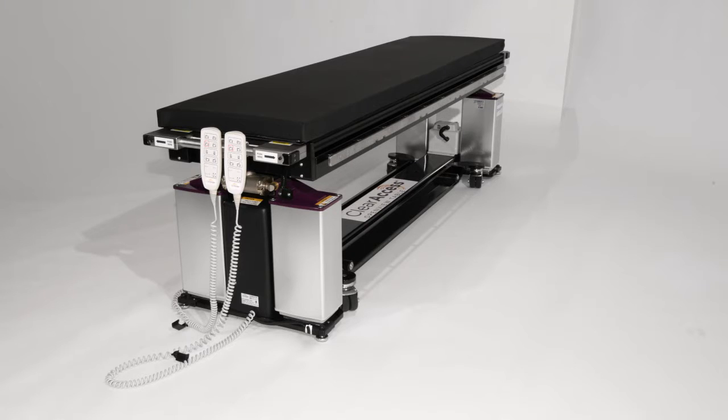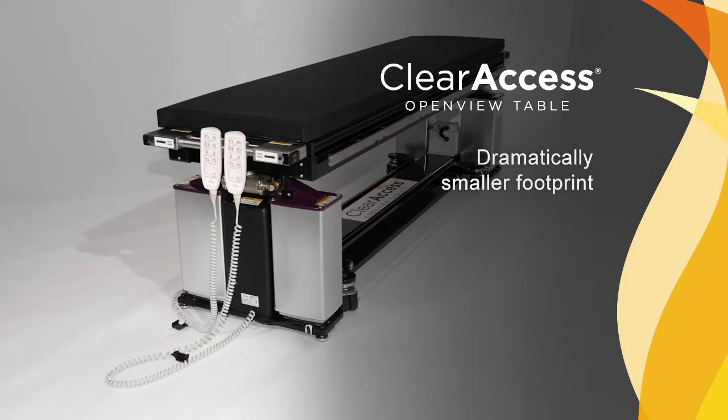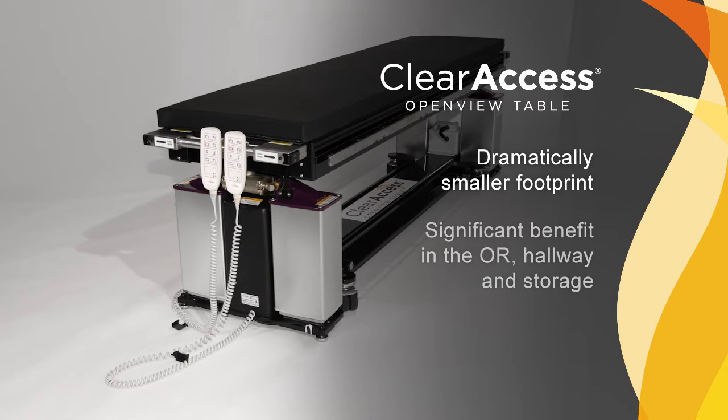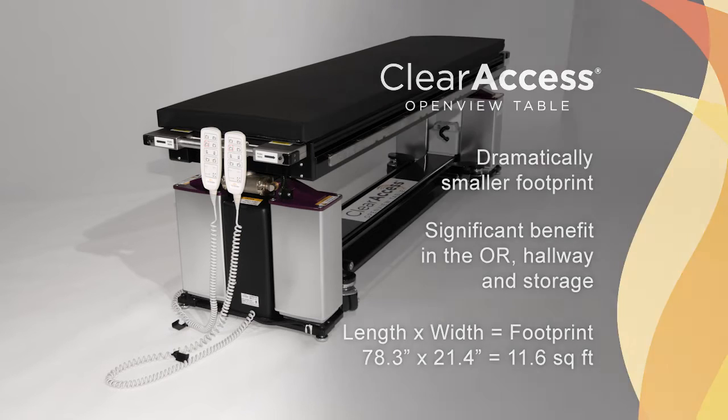Without outboard wheels and towers, the Clear Access Table has a dramatically smaller footprint than competitive systems. A small footprint has been shown to be a significant benefit in the increasingly crowded ORs, hallways, and storage areas of most facilities. Jackson-style tables commonly occupy more than 26 square feet of space, while the Clear Access footprint is less than 12 square feet.